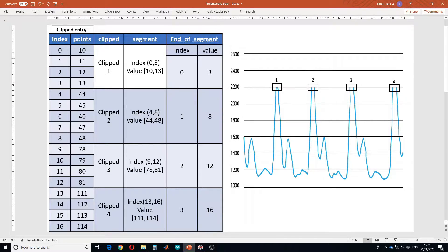The next step is to detect the end of each clipped segment. If we subtract each entry from the entry above it, we get one if we are within a clipped segment, and the difference will be greater than one if we are at the start of a new segment. In this way we can detect the end of each segment. We code it so that whenever the difference between two entries is greater than one, we save the index of the previous entry — for example, three, eight, twelve, and sixteen for the last one.